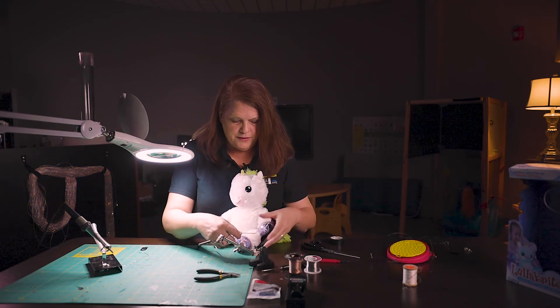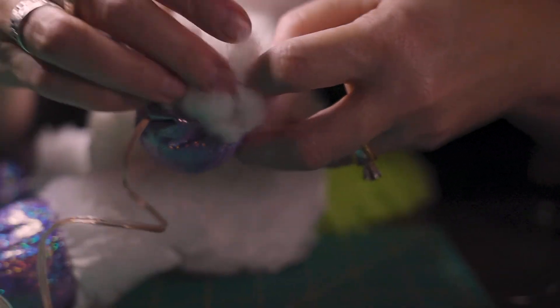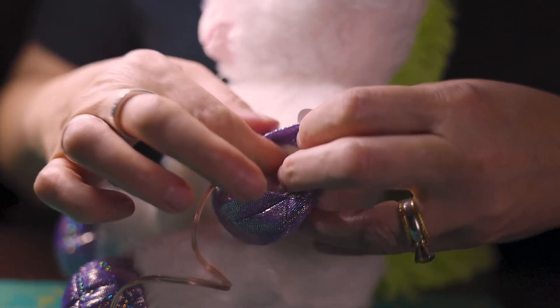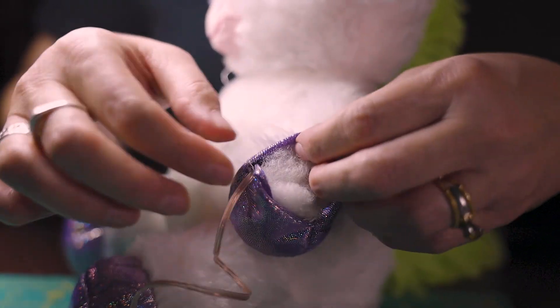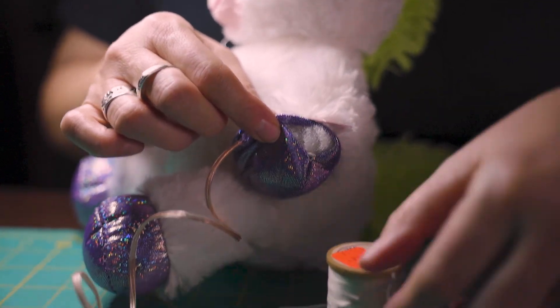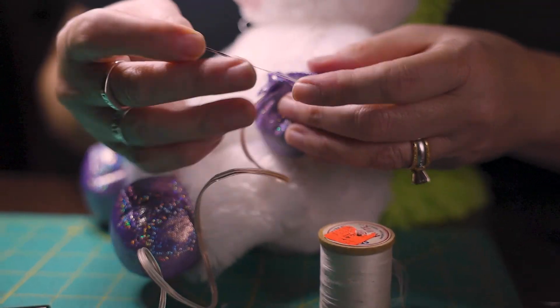Make sure after you have done all the steps that you put back in the stuffing for that little hand — get it all stuffed back up. And then you can stitch it closed to make it extra safe for that little one.